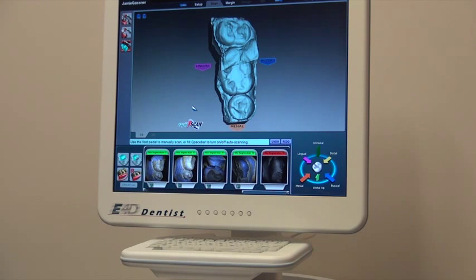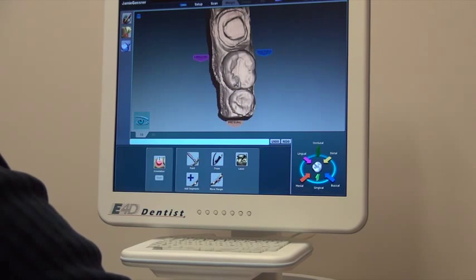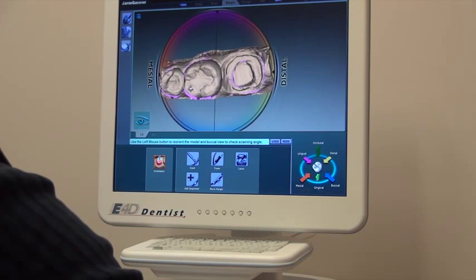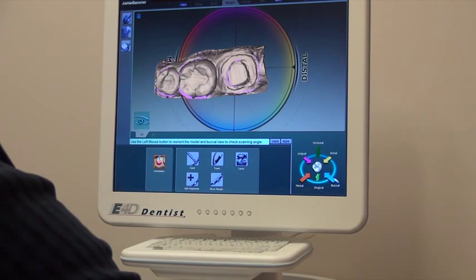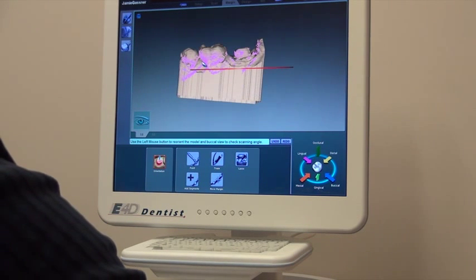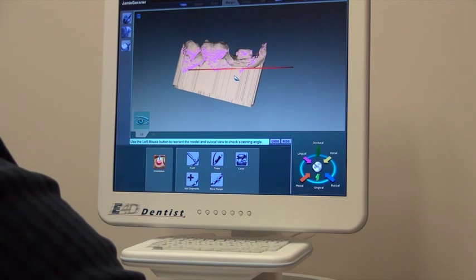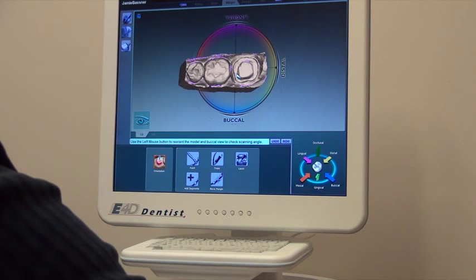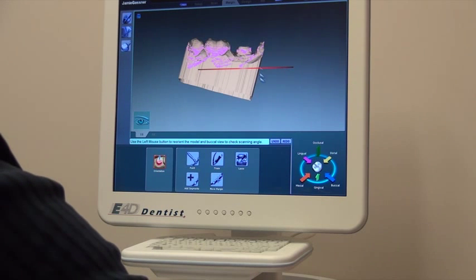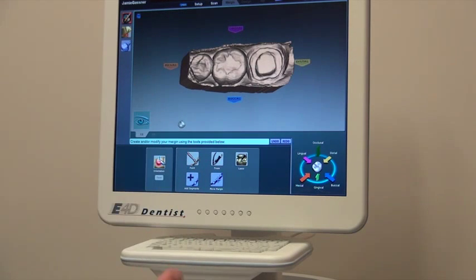Now we're ready to go ahead and start designing the crown. We'll go to the next page, which is the margin, and we have to center it in relation to where we want it to be. Let's look at it from the buccal angle — we want to lean that up so it's coming at it straight. Let's also look at it from the biting surface. We'll move it over to center, back to buccal. We have it relating there and that'll establish the draw angle for the crown.